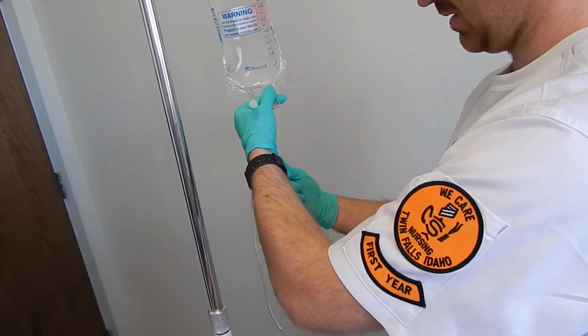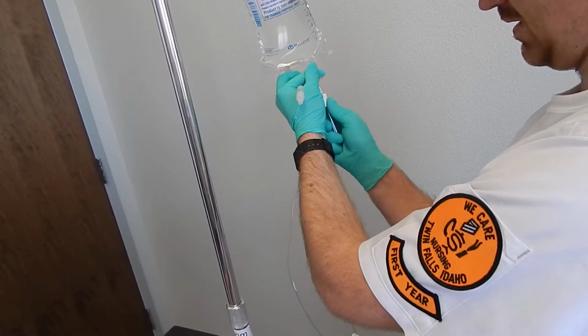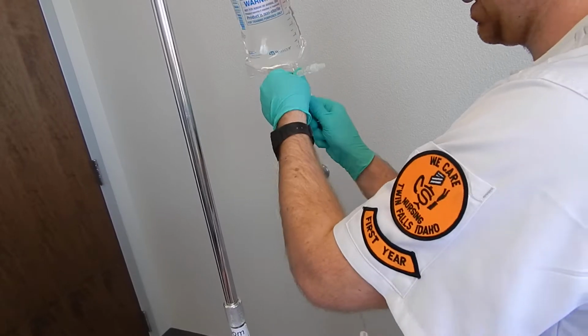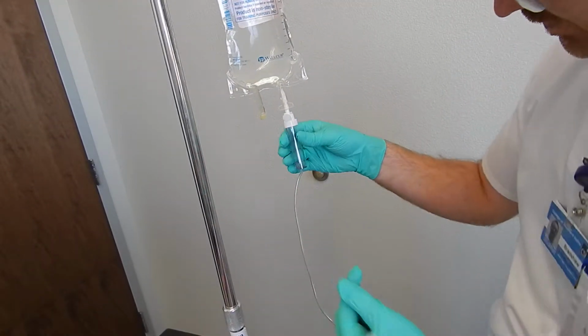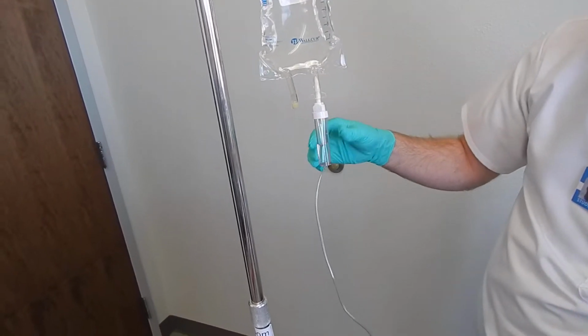Go ahead and not touch the sides, and then I'll go ahead and stick my bag all the way up there. Okay. And go ahead and squeeze it so it's about halfway full there.